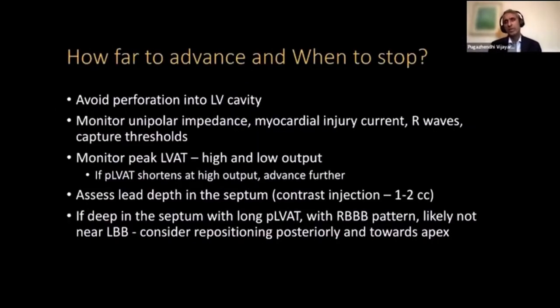So as long as the implanter, the operator, understands the sheath to septal orientation, then it becomes easier.